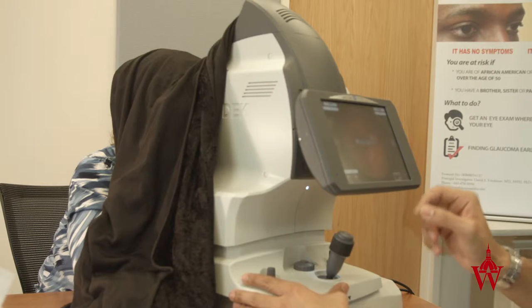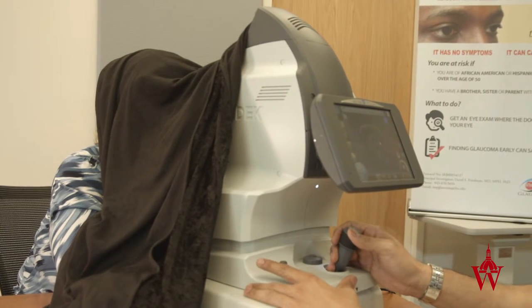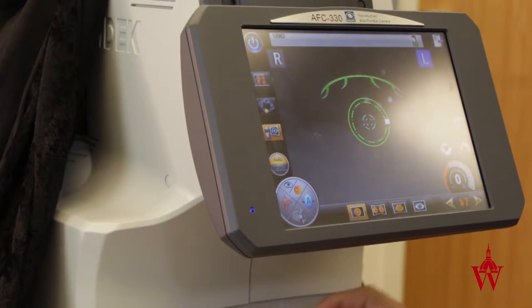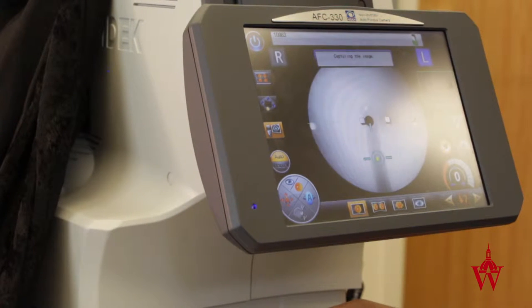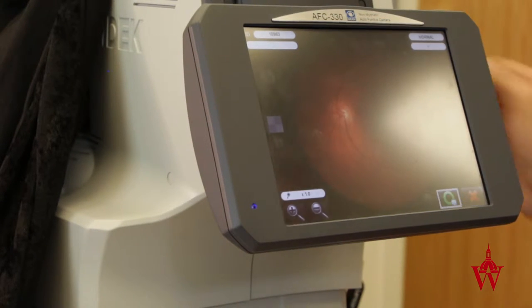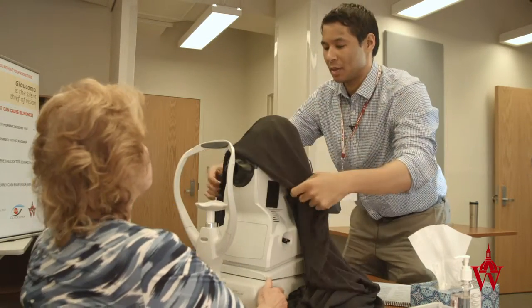Wonderful. I'm going to switch eyes. Close your eye for a moment. Open, nice and wide. Focus again on the green light. There you go — here comes the bright flash again. I'm going to take this drape off and take a look at your photos to see if we can get you moved on to the next station.